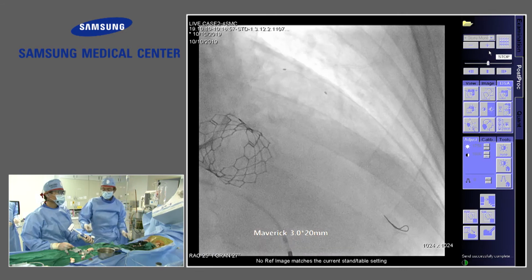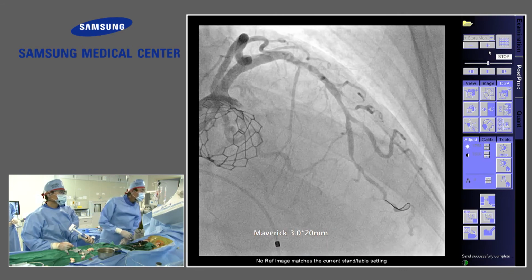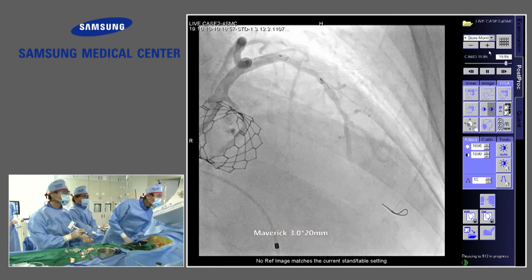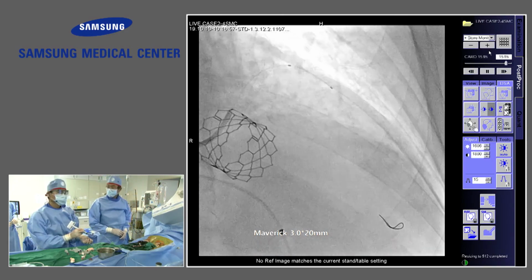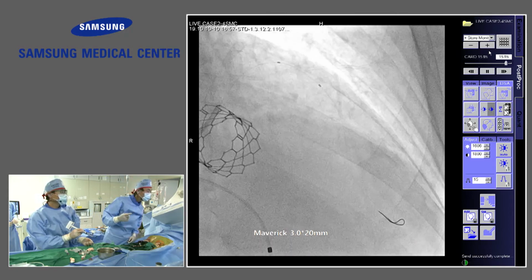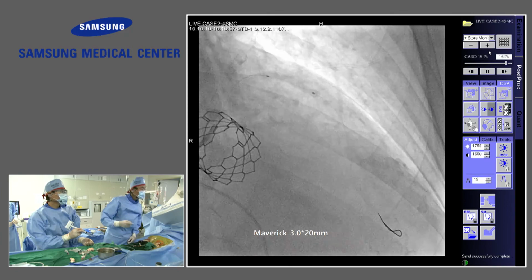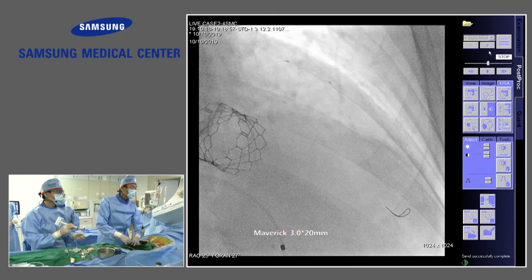Okay, and you ready? Sure. 3.5, 4.0? Which one? 3.5. Yeah, 3.5 is a little bit hard and we need high pressure.